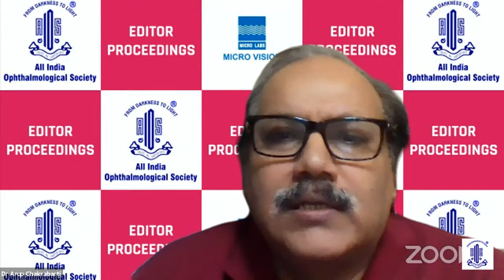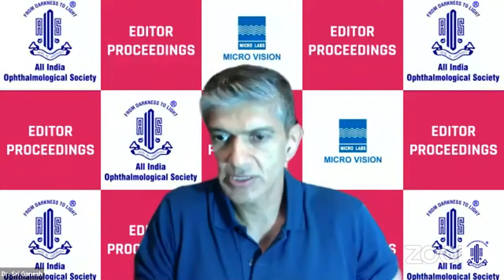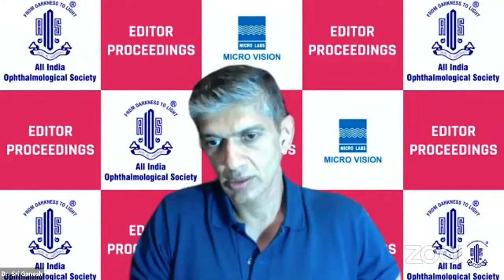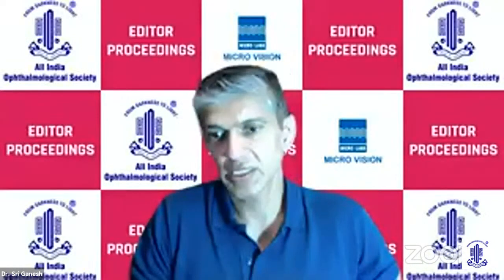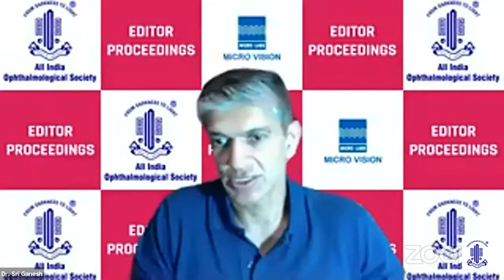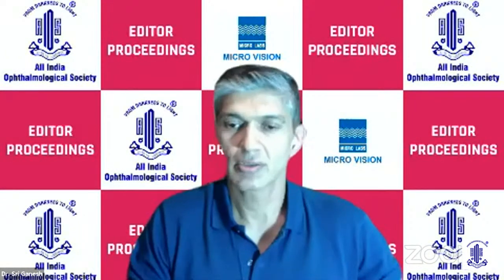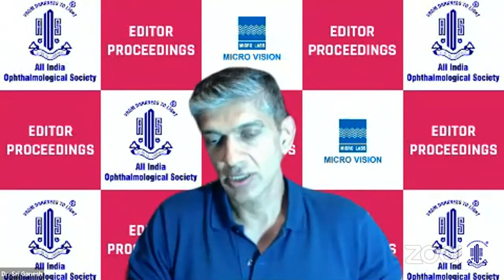Dr. Sri Ganesh? Yeah, I do A constant optimization for all IOLs, and I think every surgeon needs to do A constant optimization, because again surgical technique can vary, and this can also give rise to a little bit of change in the post-op refraction, like the size of your incision, etc. So I think every surgeon should have their own A constant for each lens, and then enter it accordingly.